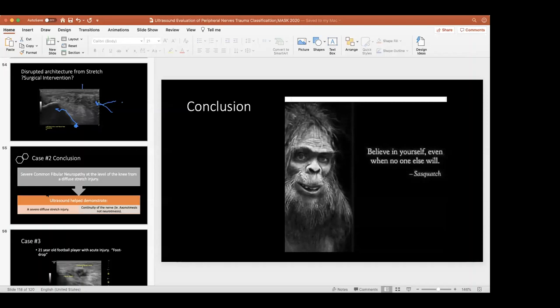And also there's one way we can do as interventional physicians, and they can do a little bit of hydrodissection around that nerve. My advice is not to put lidocaine into your solution, just use 5% dextrose around the nerve. If you can make the nerve better, apart from the electrophysiological point of view, if the 5% dextrose can eliminate the patient's neuropathic pain, that means this nerve can survive.